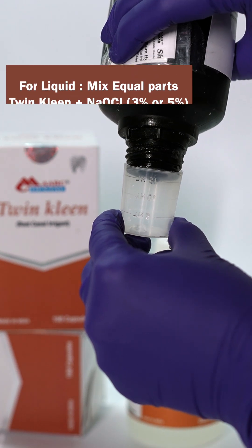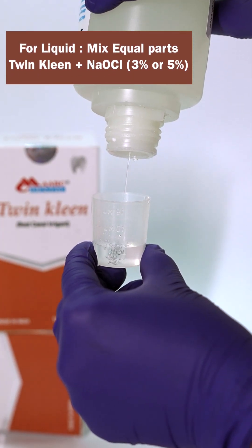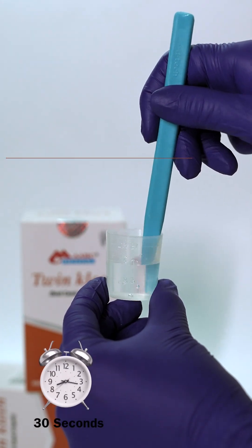For liquid, add equal parts of TwinClean to fresh sodium hypochlorite. Stir gently for 30 seconds and let it rest.